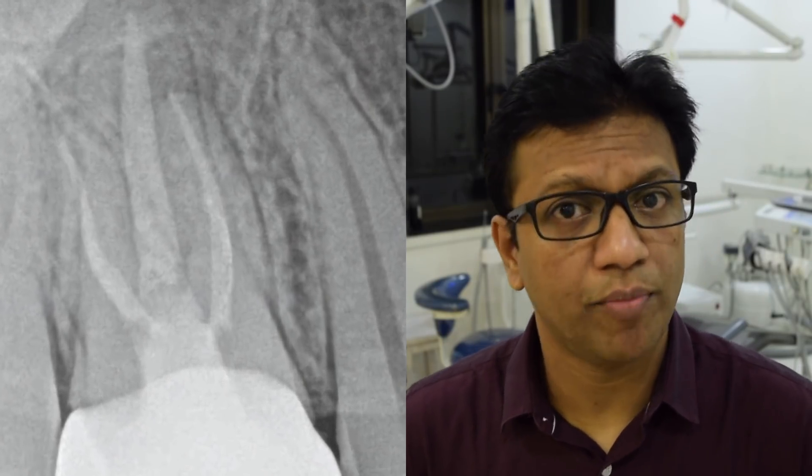Starting with this case — a maxillary first molar where there is a periapical lesion associated with the meso-buccal root. My goal was to re-treat only the meso-buccal root, doing a selective re-treatment for the MB root. There was also a missing MB2 canal. The first file used in this case was the endosonic file.